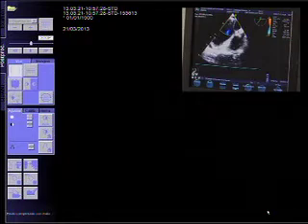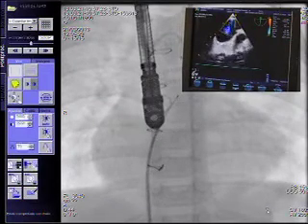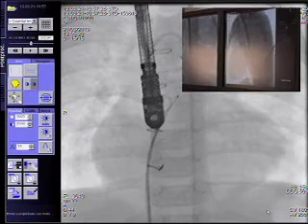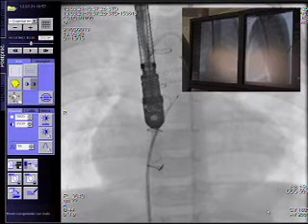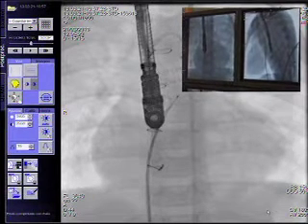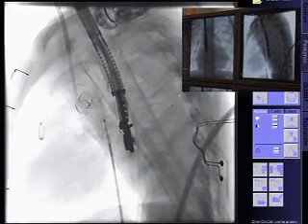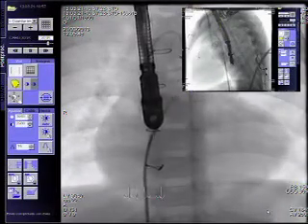Yeah, we see some bubbles in the left atrium. Yes, I will inject on the fluoroscopy. Please show the fluoroscopy, both planes, en los dos planos de fluoroscopía. Can you see both planes? Not very well. We can now, yeah. Okay, I will inject. So it's right on the roof. Yes, well done, it is.